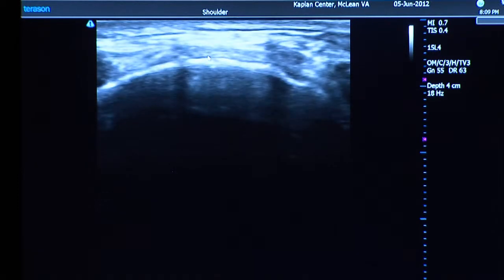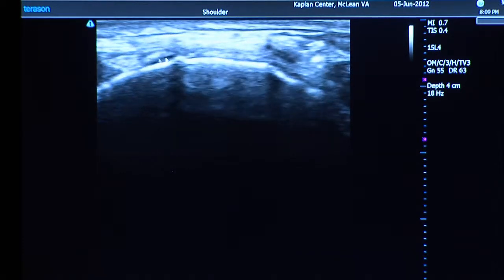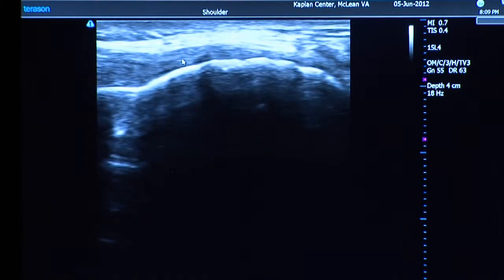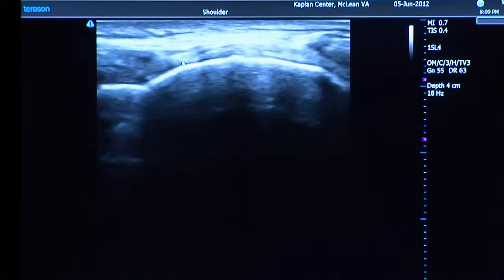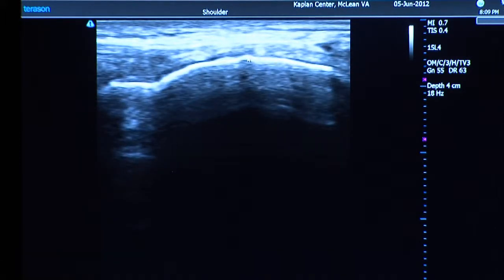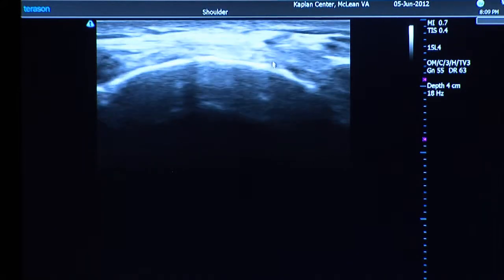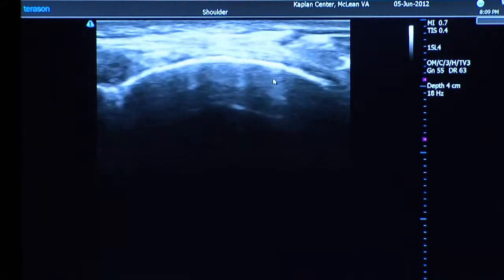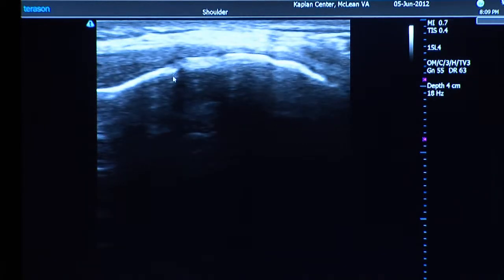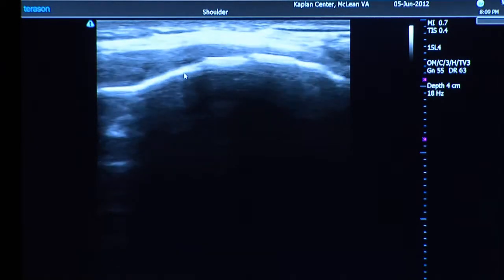The medial collateral ligament attaches to this region right here, and I can already tell it's been under a little bit of chronic stress — the surface of the bone is a little bit rocky. You see that tiny bone spur right there? It's not perfectly smooth, which indicates there has been some stress to the area. It's not really bad, just a sign that you've been active.